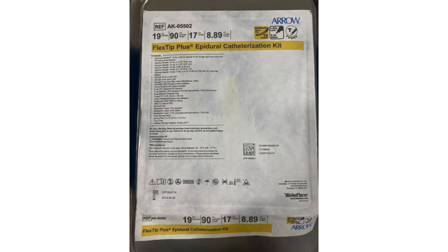Now that the insertion site has been marked, I'm going to open the epidural kit. Keep in mind that epidural kit contents and layout may vary slightly between institutions, so it is important to familiarize yourself with the specific setup at your facility. Before you open the kit, make a note of the lot number and make sure it has not expired. This kit has expired but is not going to be used on a real patient and is for demonstration purposes only.